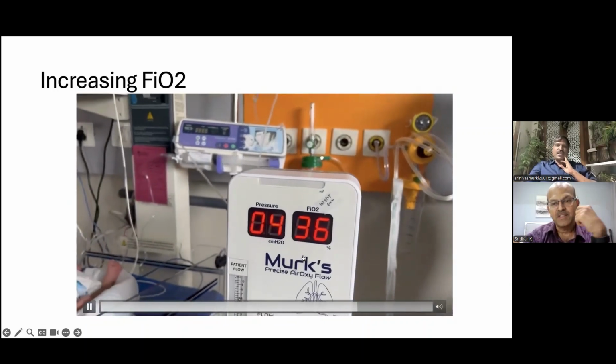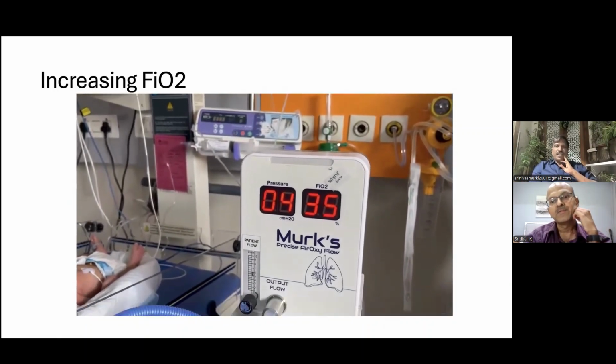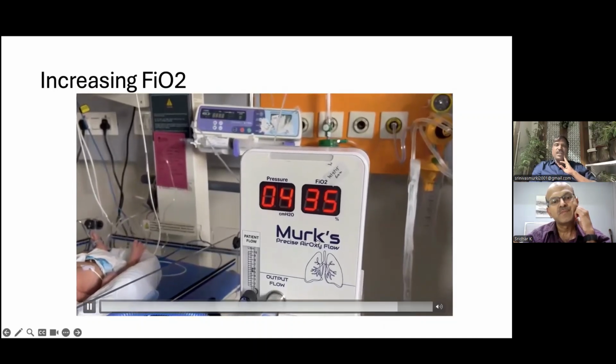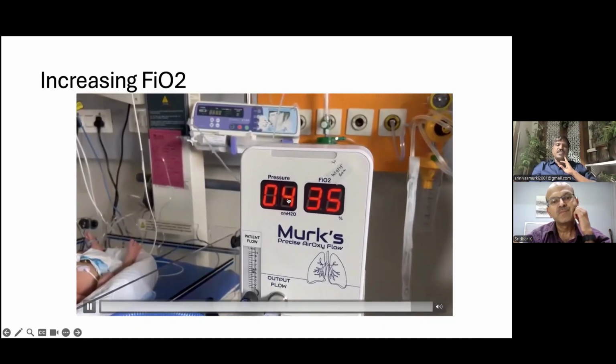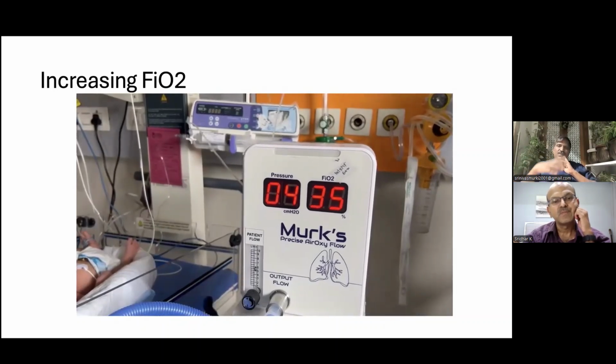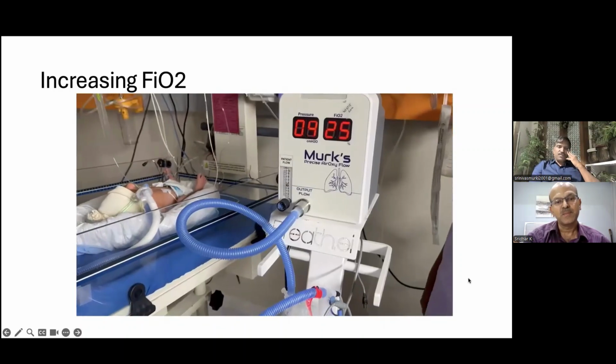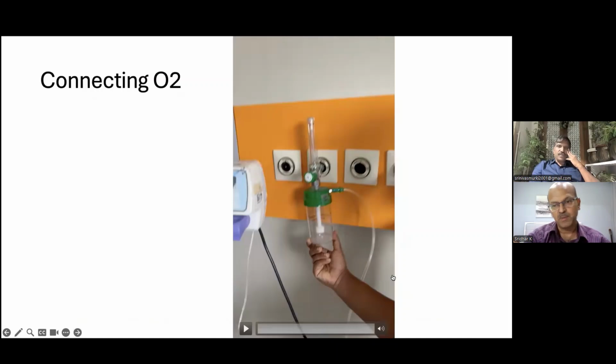Did you measure the pressure in the nasopharynx or anything like that, as the Australian studies are doing? Yes, we did measure and then we calibrated to see whether it's working. But it's very simple, isn't it? This is the display and you have a bubble jar showing the pressure there. Obviously nothing can be better than the bubble jar pressure display. So this is the digital display and you have the bubble jar display there. It's the same as the indigenous CPAP that we use and the bubble CPAP. So it's easy to understand for everyone who's using it.